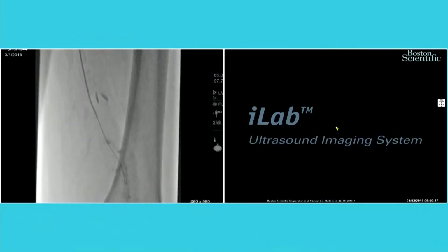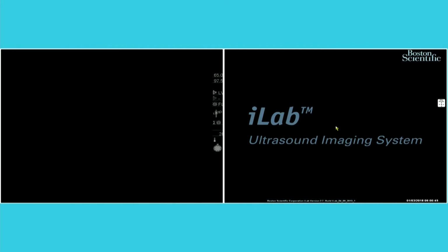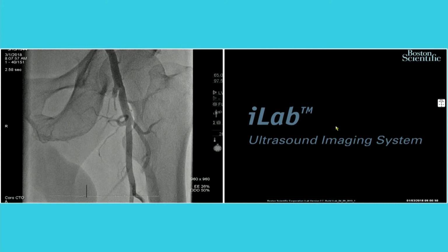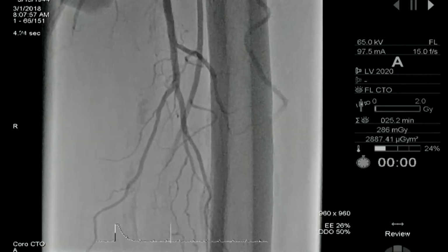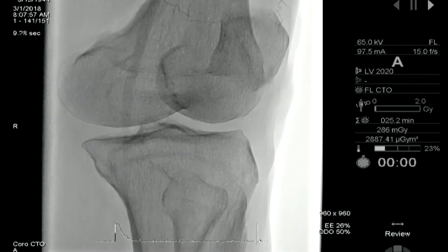Okay, can I go first and show you the first one? Can I have the first picture? Okay, so we went crossover from right to left, and this is the angiogram which we saw. There is a total occlusion of the superficial femoral artery just after the origin. You can see there is a bifurcation of the common femoral and there is a good profunda femoris. Can you play this? And then the superficial femoral actually constitutes as above knee popliteal.